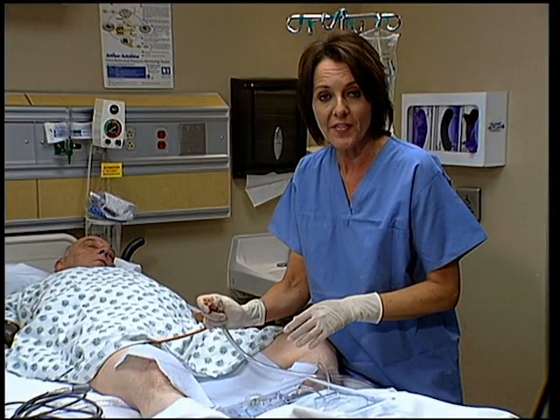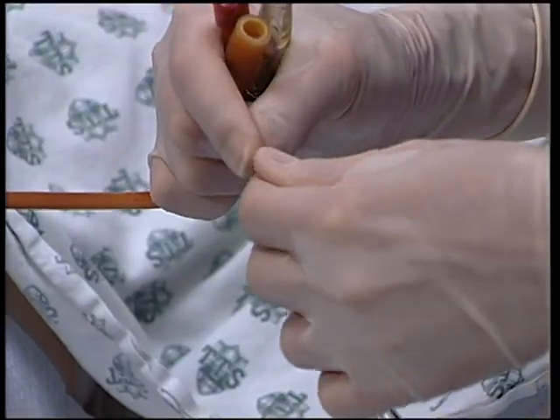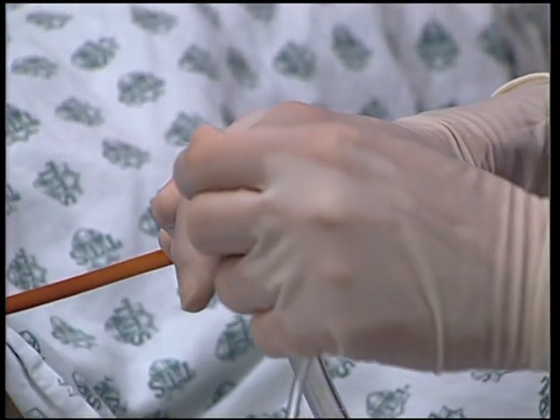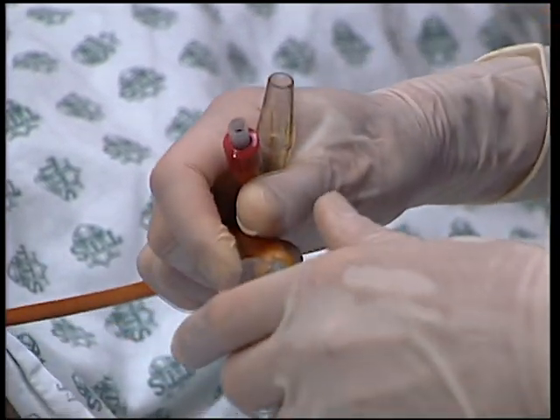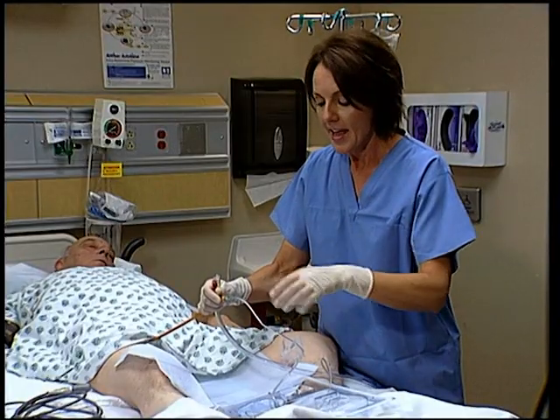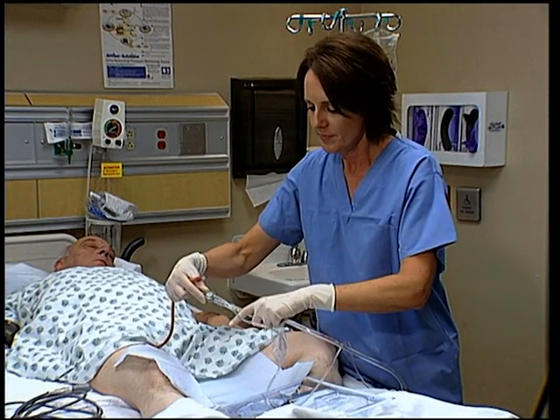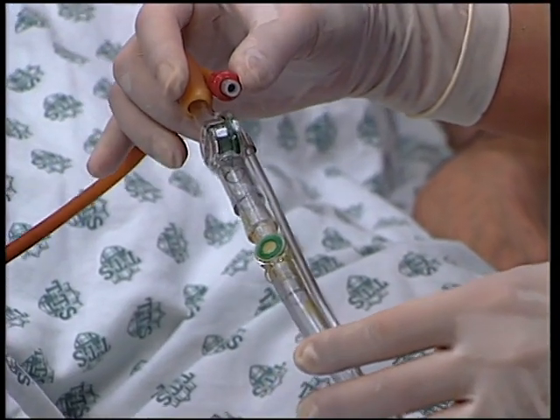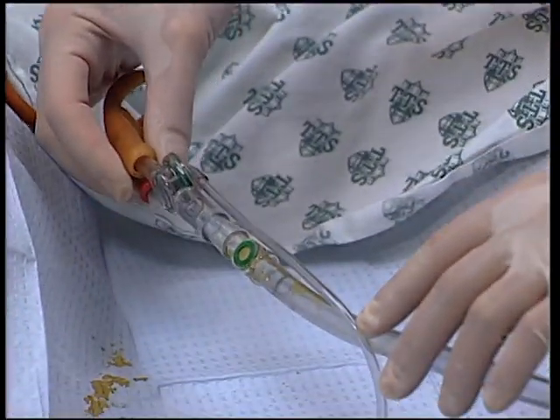Pick up the AbVisor valve and tear along the perforation of the protective bag, exposing the barbed connector. Push the urinary catheter over the barb. Then slide the protective bag down the tubing, exposing the urinary drain connector, and connect the drain tubing to the AbVisor valve. You may now tear the protective bag at the second perforation and discard it. Set the Foley valve and drain tube back down between the patient's legs.